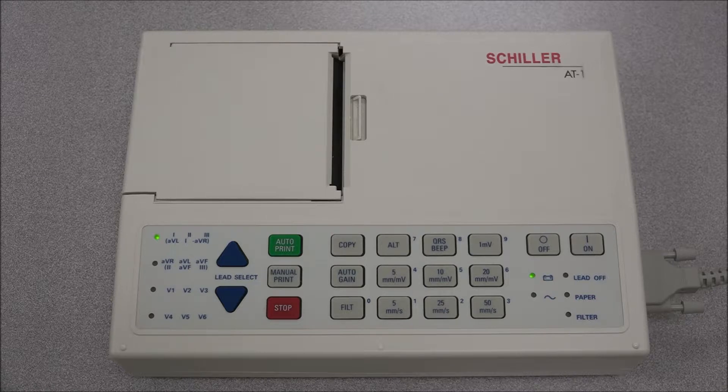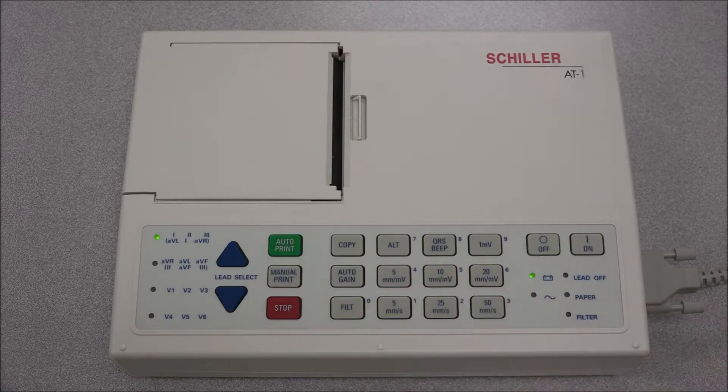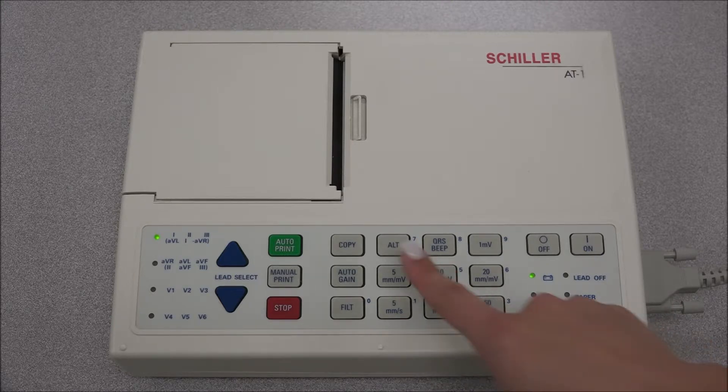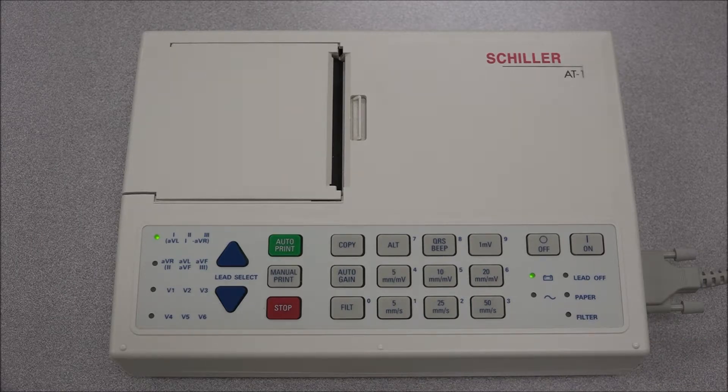To take a recording of an automatic ECG, press the green start key. The printout will be obtained in format 1. To make an automatic recording in format 2, press the ALT key followed by the auto start key. If you wish to obtain an extra printout in format 1, press the copy key. To obtain an extra printout in the second format, press the ALT key followed by the copy key.